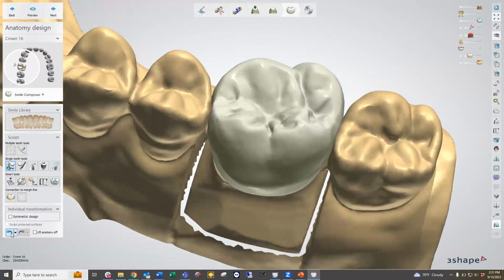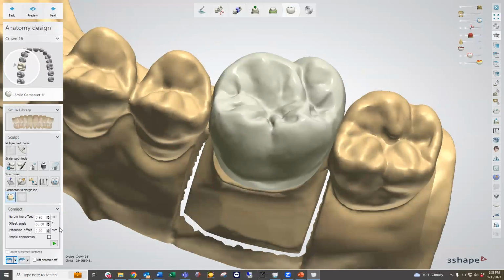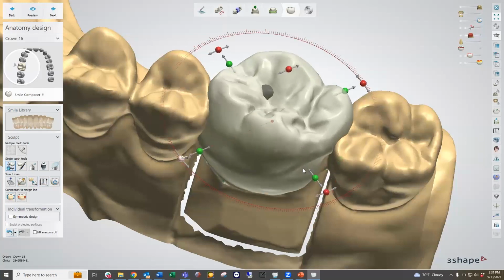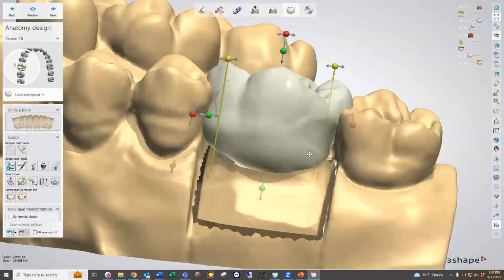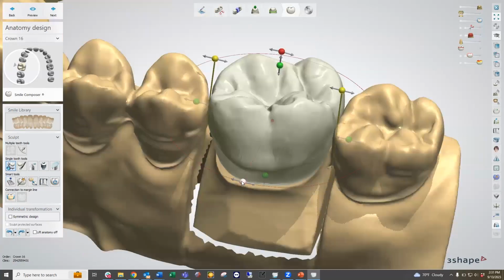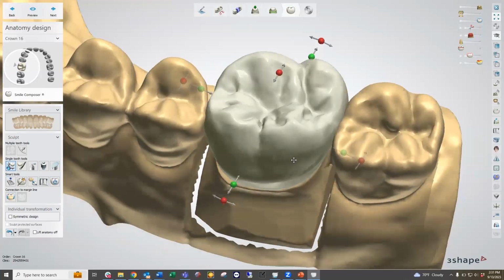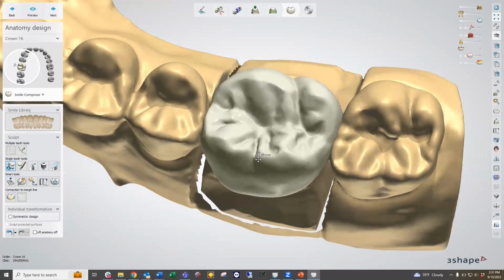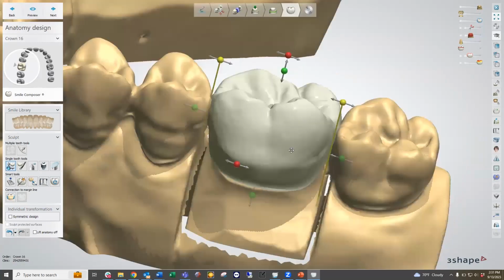If I had connected it to the margin line initially and then made those changes, you tend to get a twisting or rotation happening to your crown, and it tends to twist down at the bottom here. This is a little exaggerated, but it gives you an idea of what you're seeing. I don't like to work with that sort of surface. Rather, I like to start with a freeform aspect and make it into place, then make the adjustments as needed. After I've made my big adjustments, I can connect it to the margin line.